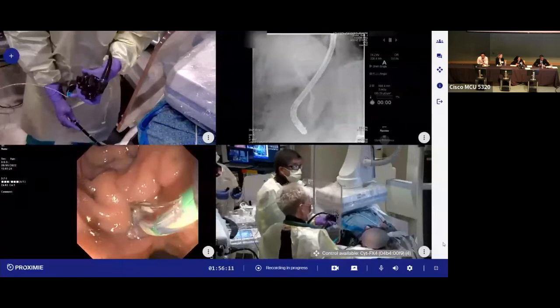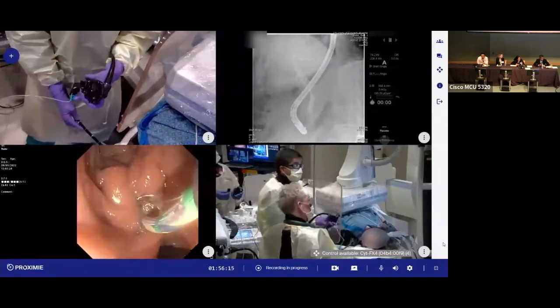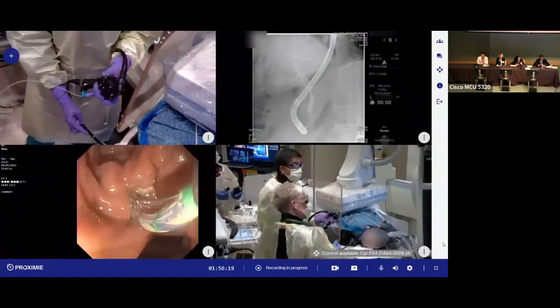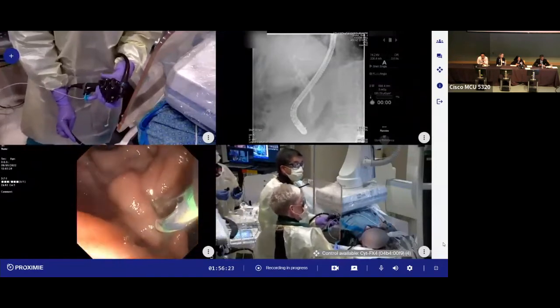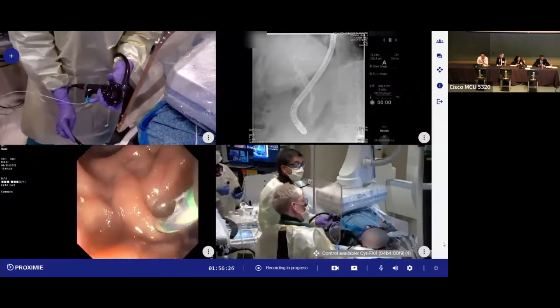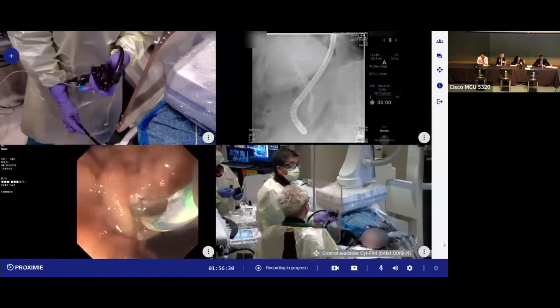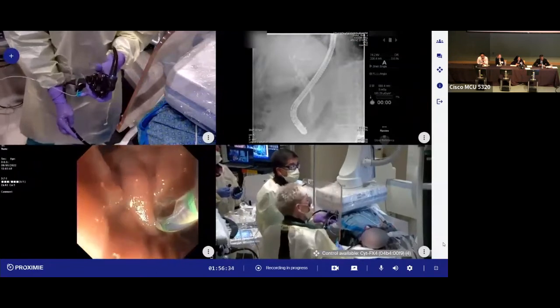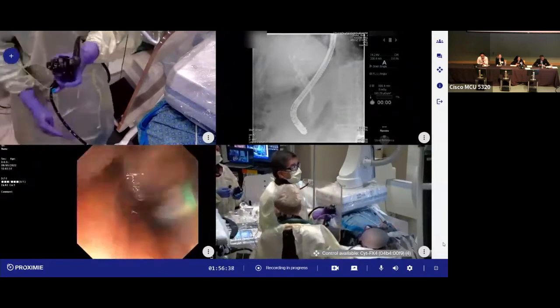So hands are still here, big wheel is closer to me. Okay, let's go. What do we got? You know, could we just do a sphincterotomy alone and just take these stones out? Why balloon dilate? Right? Yeah, I mean, that's a reasonable first step. Maybe the stones are small, maybe they'll come through the sphincterotomy. Yeah, that's possible. All right, relax all the way.